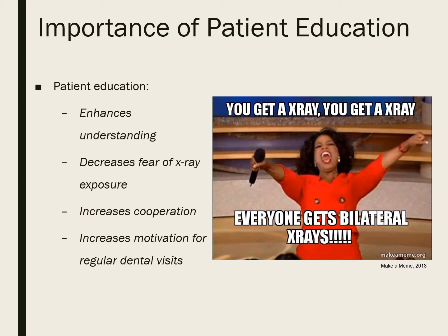It's going to increase motivation for regular dental visits as well. Patients understand that not every single time they come into the office they have to get X-rays. It's all based on their individual needs. And so when a patient comes in thinking that they only come in once a year, or only every couple of years, they think every time you go to the dentist you get X-rays, and that's not necessarily true.